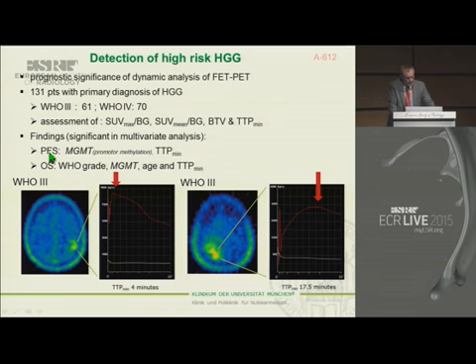For the progression-free survival, besides the promoter methylation, it was the time to peak in minutes. What is meant by that is if you have a tumor which peaks very early and has a very quick washout, this tumor has a worse prognosis.